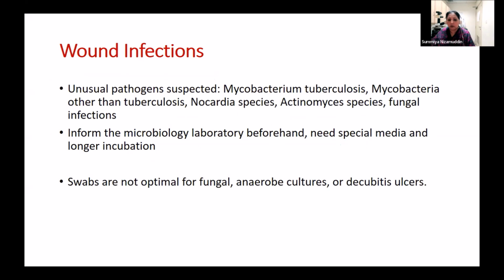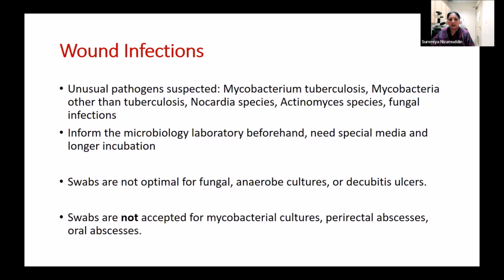Please note that swabs are not optimal samples if you are suspecting TB or fungal infections. It's always better to send tissue or aspirate samples, and swabs should be avoided in these scenarios. Swabs are also not accepted for TB cultures, perirectal abscesses or oral abscesses, not recommended.